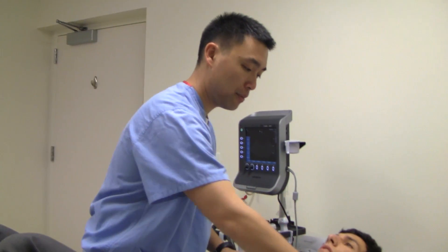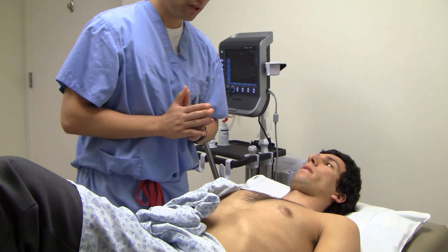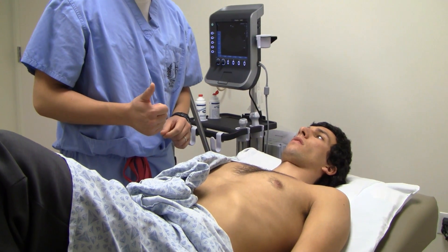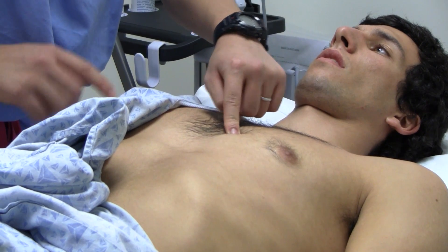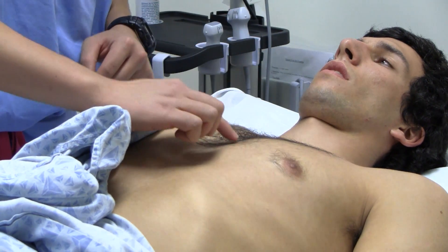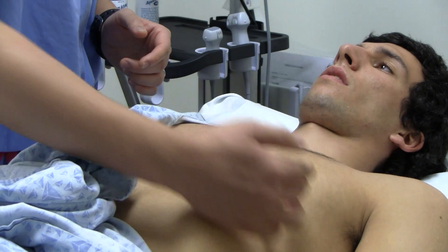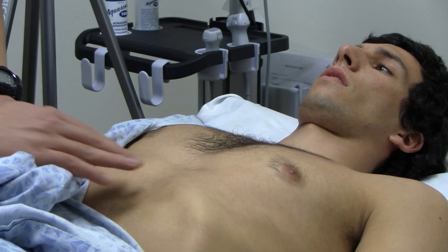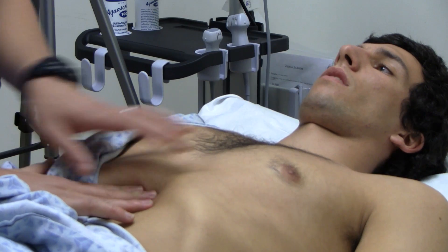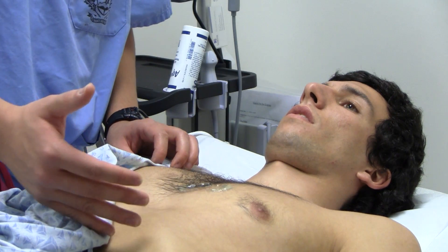Before we start scanning, we're going to try to optimize the patient position. First, you're going to undrape the patient on the left side. We're going to teach you a few different views, and it's really important to know your anatomy. The first view is the parasternal view — both long axis and short axis. For the parasternal view, you place the probe right next to the sternum at the nipple line, angled at 45 degrees, because that's the direction of the heart. Then we move to the PMI for the apical four-chamber view, and we'll end with the sub-xiphoid view, where you put the probe down here and go through the liver to see the heart. We're going to put the patient in the left lateral decubitus position to optimize our views.